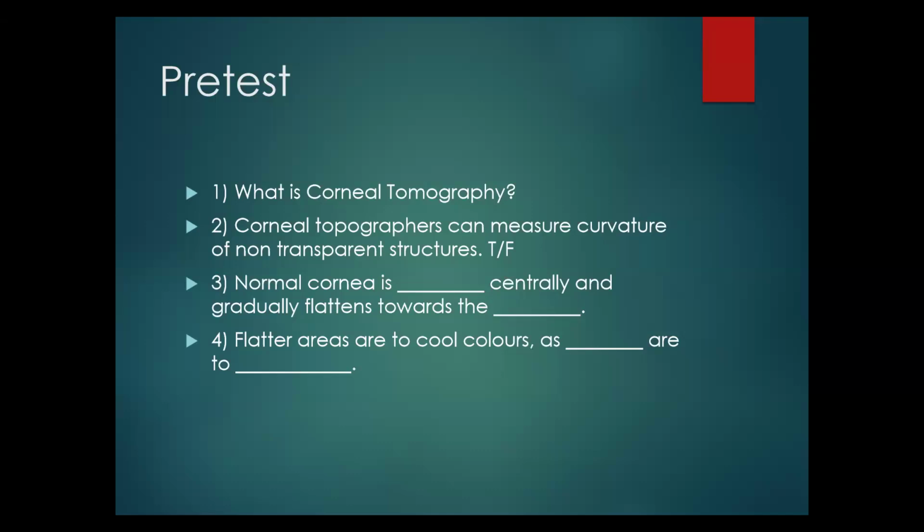Like a three-dimensional view. I agree with Dr. Owe on that definition. Tomography has to do with sectioning. But if you hear what you understand by sectioning, is it different from what I mentioned? Can you differentiate it from how I explained it?